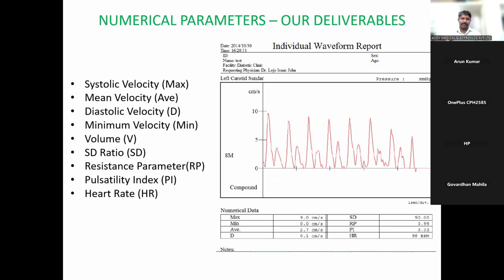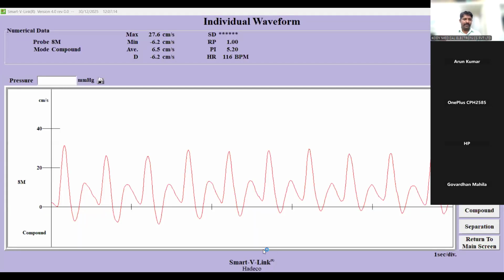And one more time, I would like to position the Doppler and keep everyone informed about the positioning of the probe in observing the triphasic waveform. Please have a look. I'll just share my screen. In a demonstration or any other activity, you just need to highlight to the customer the significance of this flow.